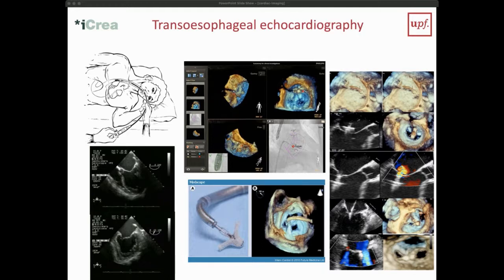And especially looking at the valves in detail or looking at the atria in very much detail is actually quite difficult. Another thing is that, of course, the farther away you are from what you want to image with ultrasound, first of all, you need to use a lower frequency, because we said you have frequency dependent attenuation. High frequencies cannot penetrate as deep as low frequencies, but low frequencies have much less resolution. So for the deeper structures, especially the further parts of the heart within the chest of an adult person, we need to use relatively low frequencies, and we don't have high resolution.